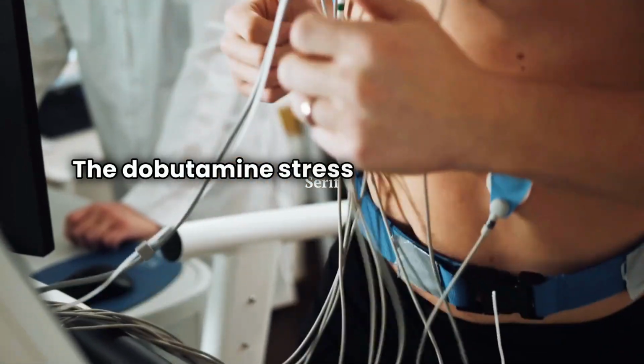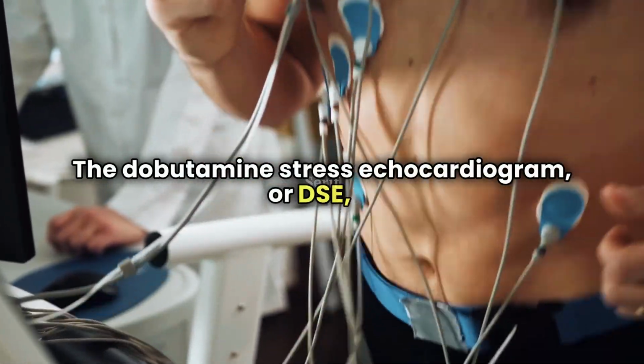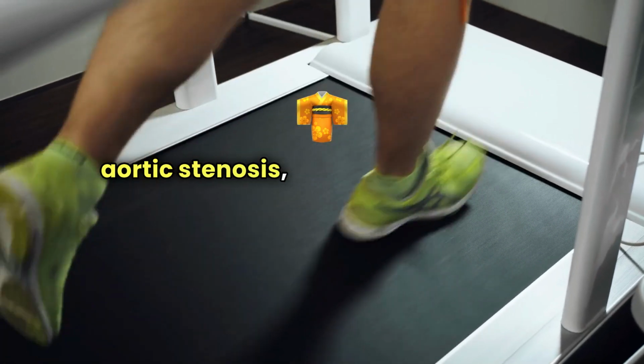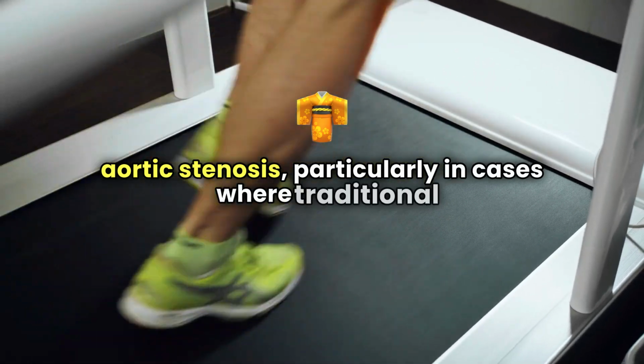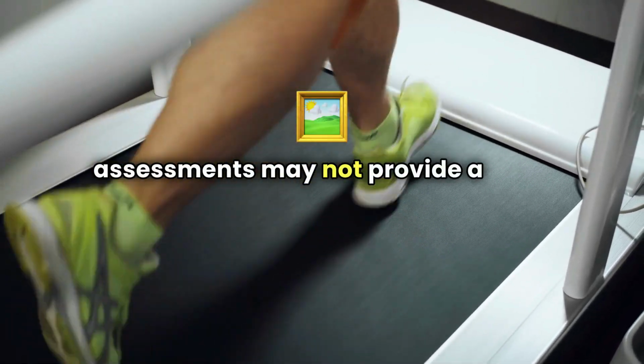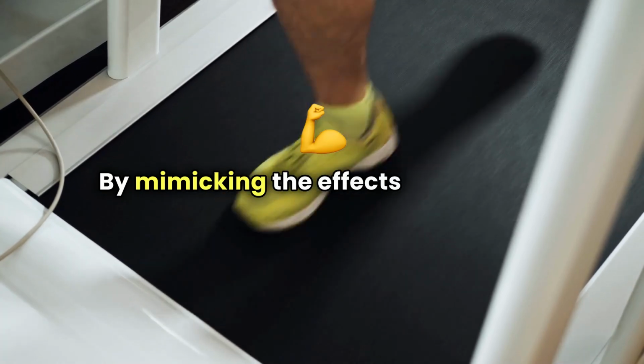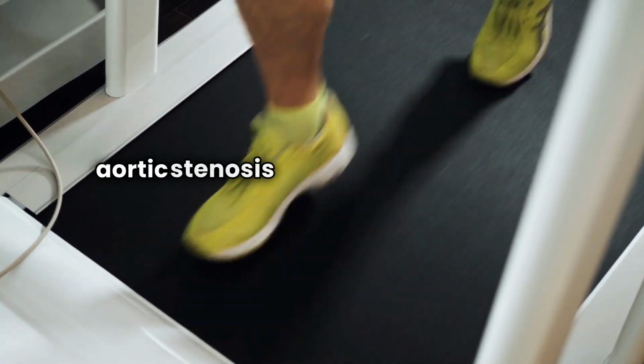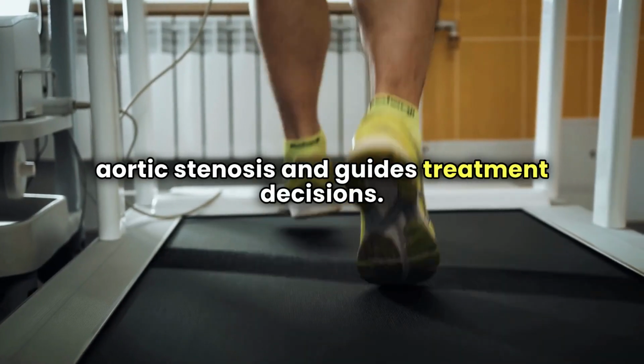The Dobutamine stress echocardiogram, or DSE, is a crucial diagnostic tool used to assess aortic stenosis, particularly in cases where traditional assessments may not provide a clear picture. By mimicking the effects of exercise, DSE helps evaluate the severity of aortic stenosis and guides treatment decisions.